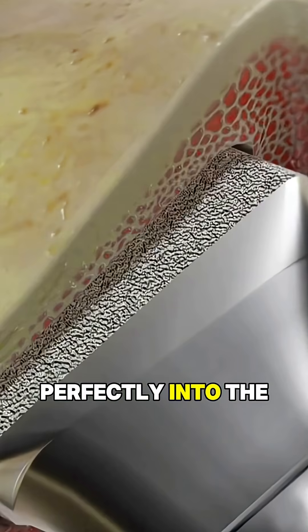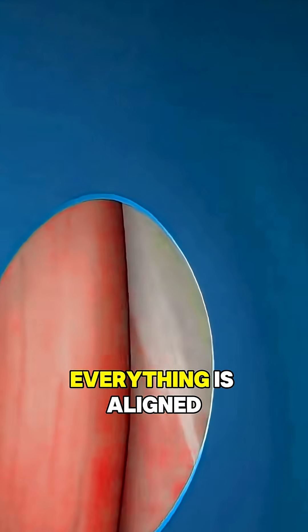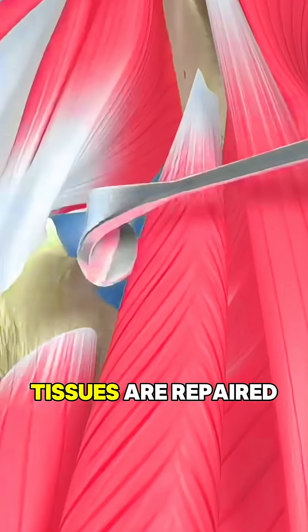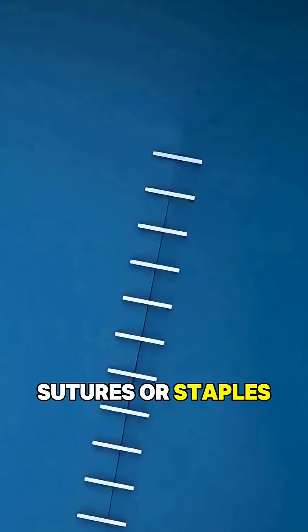This ball fits perfectly into the new socket to create a smooth, stable joint. Once everything is aligned, the muscles and tissues are repaired and the incision is closed with sutures or staples.